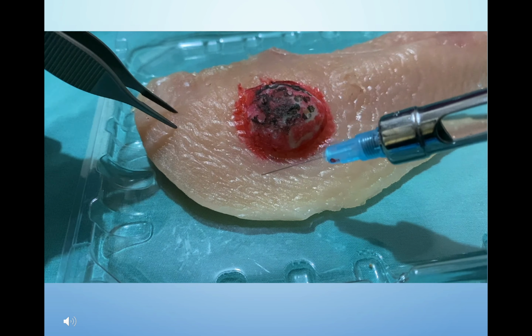If you happen to be unable to place the specimen immediately into the formalin, for example, a big surgical specimen or a big solid mass where you might need to place some orientation suture, or do some labeling on a cardboard or anything, then you can put the specimen on a damp gauze or gauze soaked with saline.